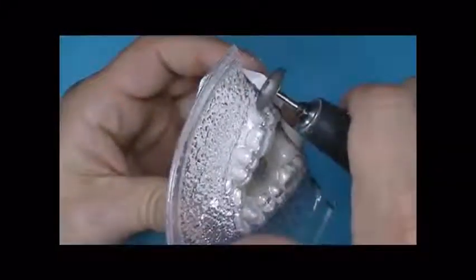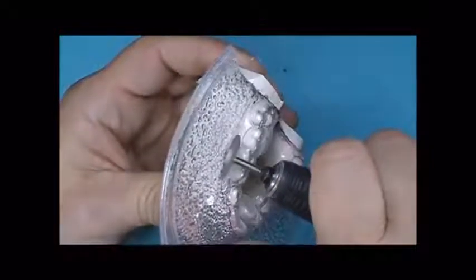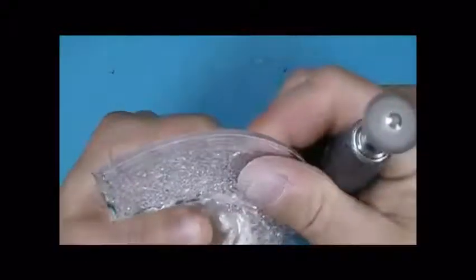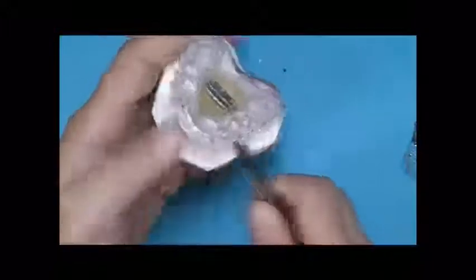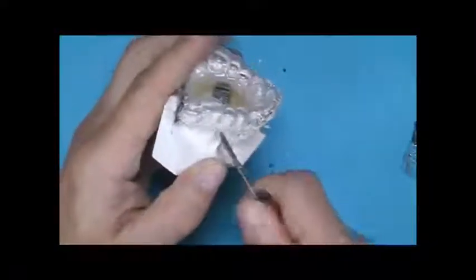Then cut plastic at pellet model junction and remove outer part of the disc. Pry off plastic from model with lab knife. Try to remove plastic level to model. Most likely the anterior teeth will break off model. They are not needed for fabricating this appliance.